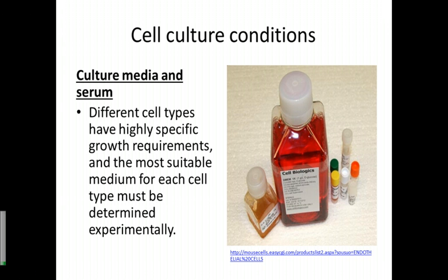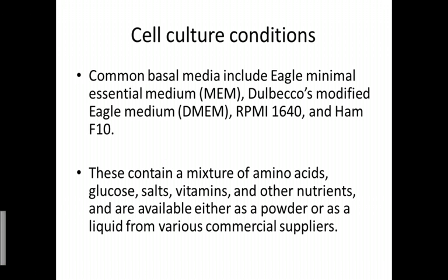So these are the physiological conditions that we provide to the cells. These include common basic media like minimum essential medium, MEM, Dulbecco's modified Eagle medium, DMEM, RPMI, and HAM-F10. All these media contain a mixture of various nutrients, for example amino acids, glucose, vitamins, and others, and they are available in the form of powder as well as liquid from various commercial suppliers.